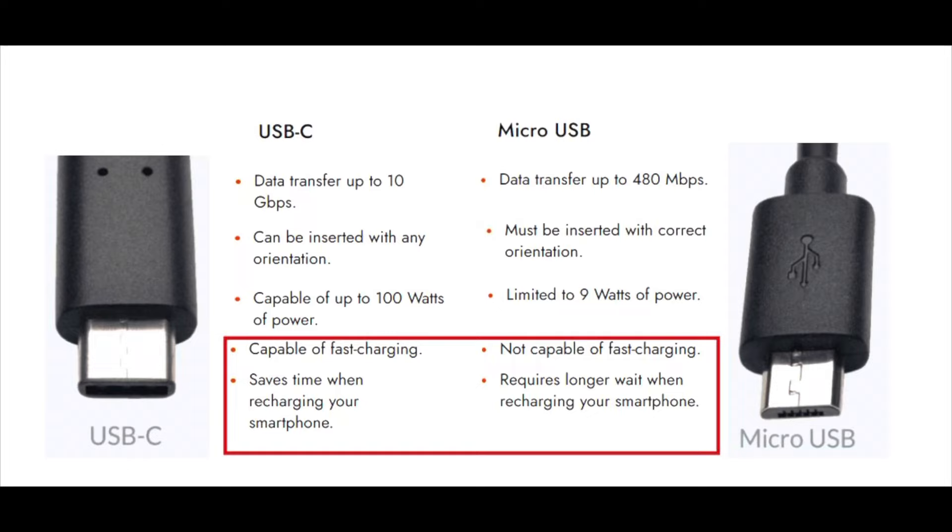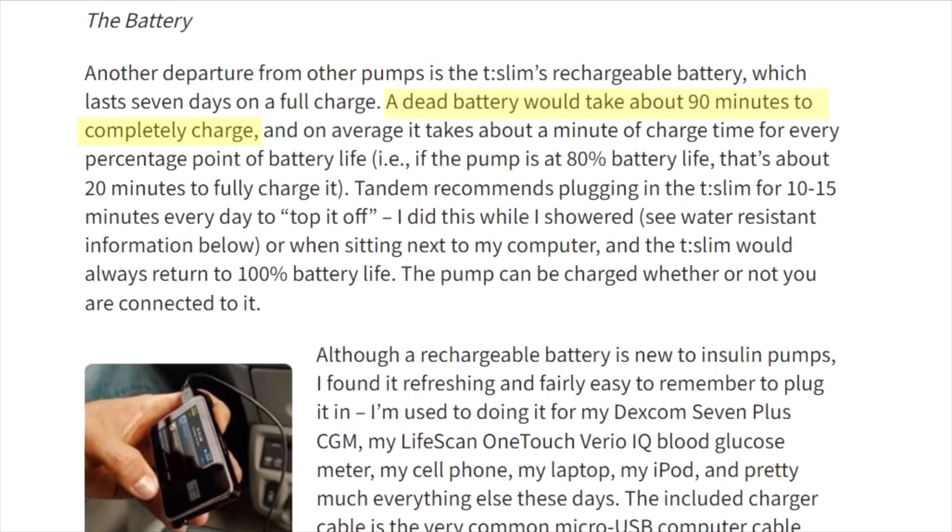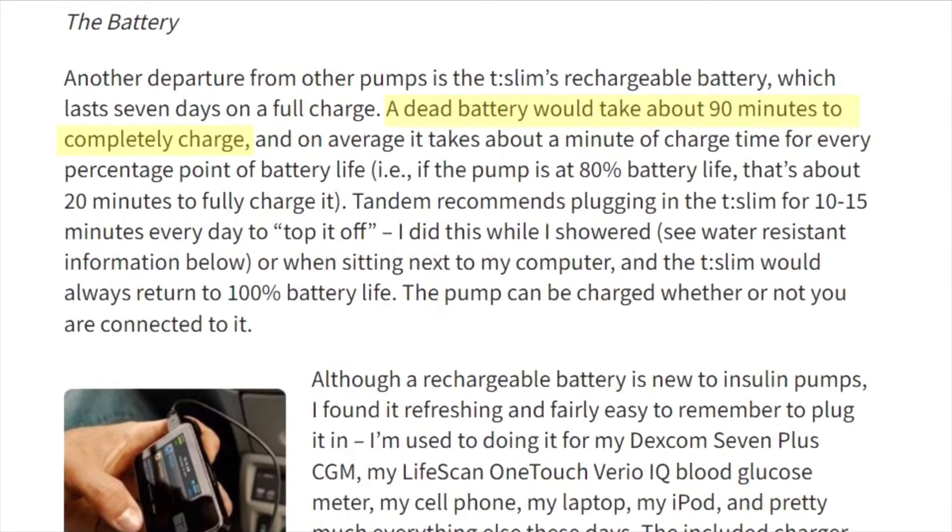You also don't ever have to worry about plugging it in the wrong way — USB-C can be inserted either way, unlike micro USB. But the biggest thing is that USB-C can charge much faster — it's capable of up to 100 watts of power compared to only nine watts in micro USB. The current X2 can take up to an hour, sometimes over an hour, to charge a completely dead battery. Having a USB-C charger could significantly cut down on that time.